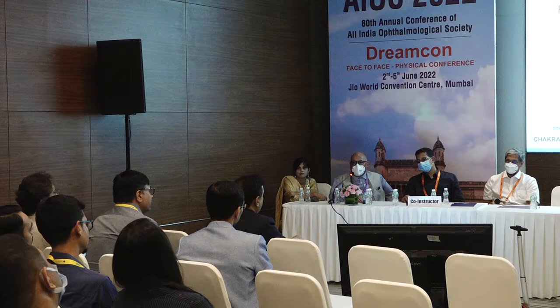Only thing was that the Barrett didn't accept a 57 K. It said beyond normal limits, it wouldn't accept. So I got stuck at that level. I have no experience with the other formula you mentioned. As you saw in this case, I have done all the calculations, and I got a range from 49 to 65. So there is no agreement amongst all this. But luckily I went with instinct and talked to a lot of people, and they said, in short eyes, Hoffer-Q works the best.